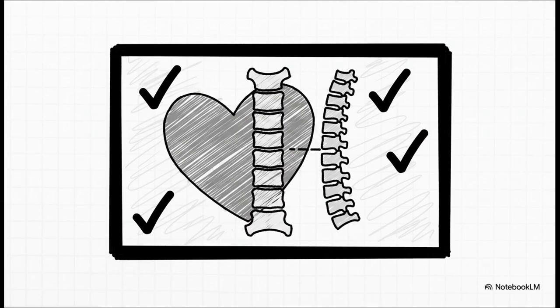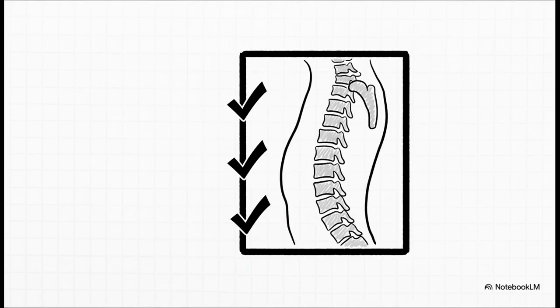Make sure the lateral manubrium is clear, and if you used a breathing technique, look for those nicely blurred pulmonary markings in the background. So, the crucial point is applying that same critical eye to your lateral view. Whole sternum visible? Check. Manubrium totally clear of the shoulders? If not, their arms weren't pulled back far enough. Is the sternum completely free of rib superimposition? That tells you it's a true lateral.